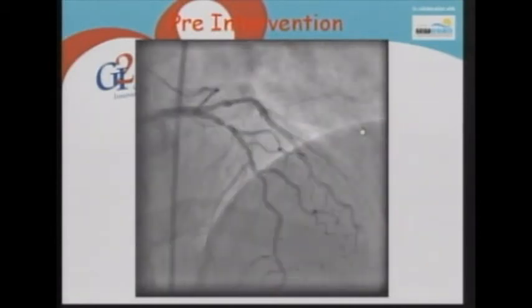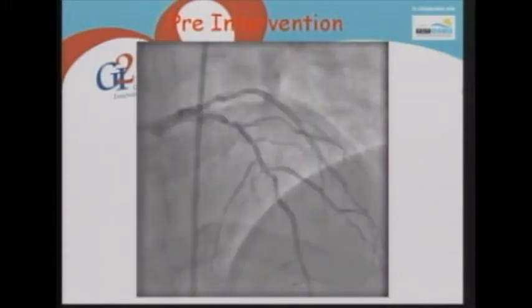Well, based on the angiographic findings and with the MIBI scintigraphy that he had showing ischemia in the inferior wall and anterior wall, our initial thought was we planned an intervention to treat the RCA and the LAD. I don't know if you want to discuss this, if you want to make any comments.